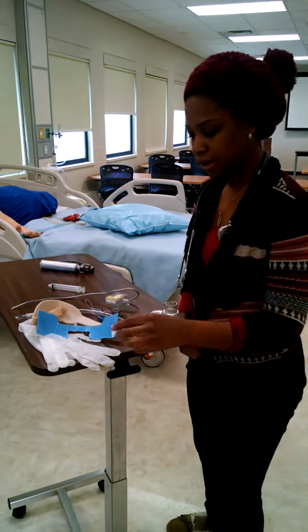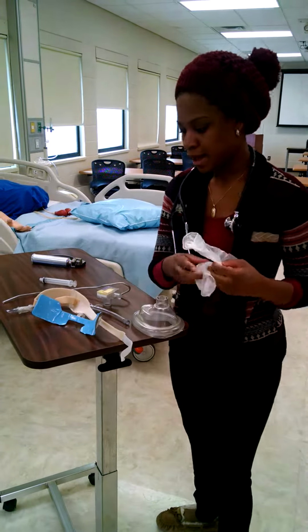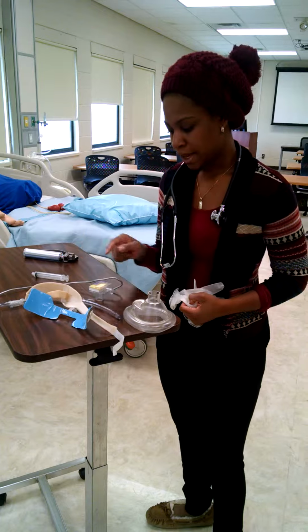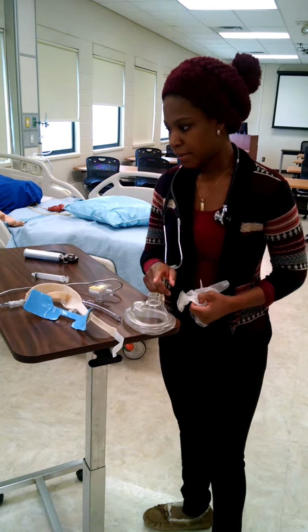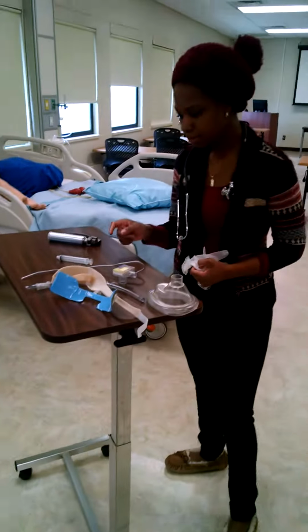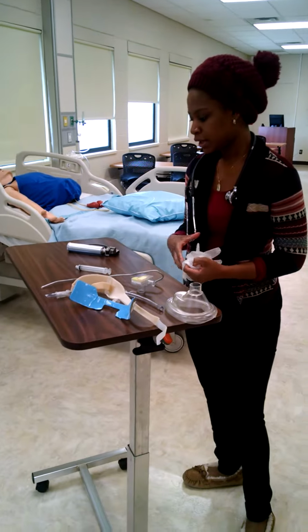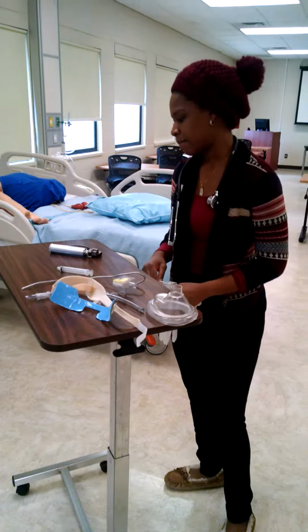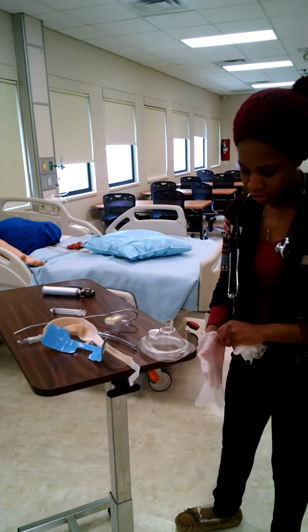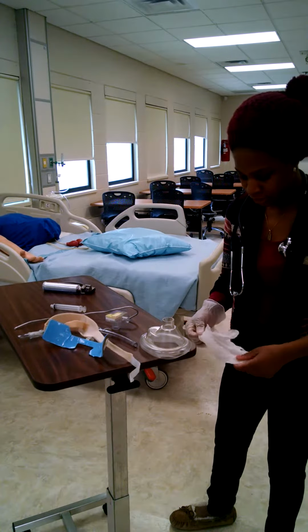It has my gloves, my ET tube holder, my ET tube, my CO2 detector, my mask, along with my manual resuscitator, my stylet, my 10 cc syringe, and my laryngoscope and Macintosh blade. I also have my stethoscope ready.